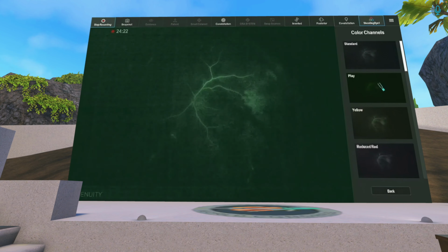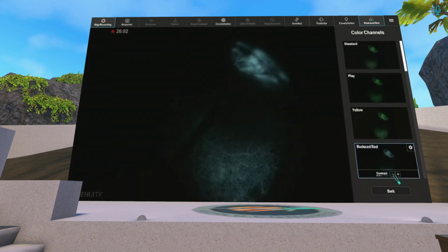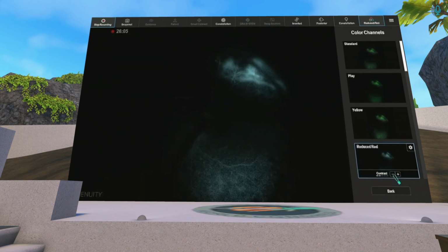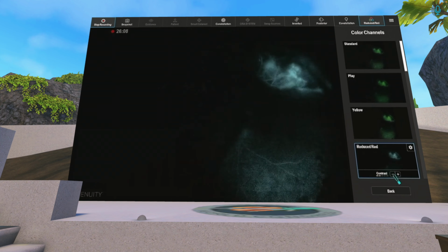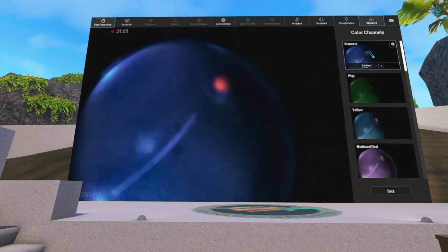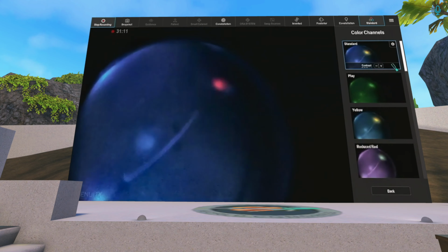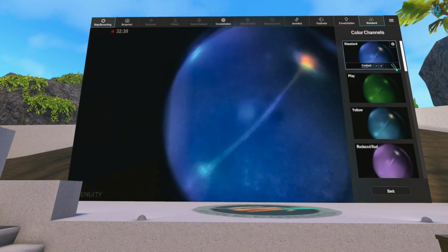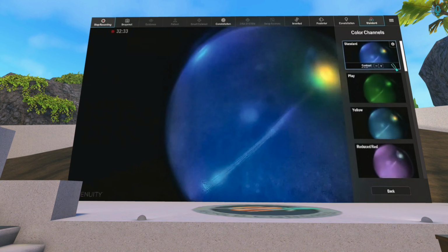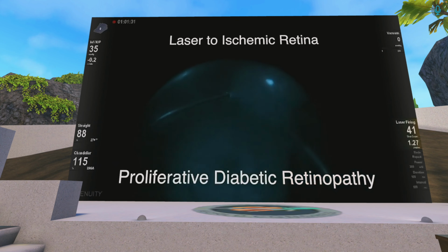And here's one, similar to what Lukan was showing, with a chandelier and the constellation. You can see these peripheral areas of intraretinal neovascularization, and we're actually treating these fairly confluently, as well as the ischemic retina peripheral to that.